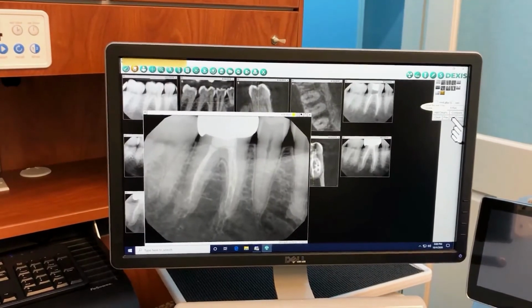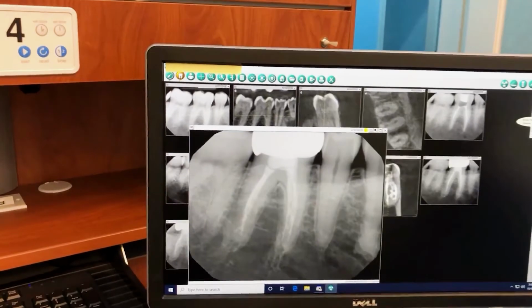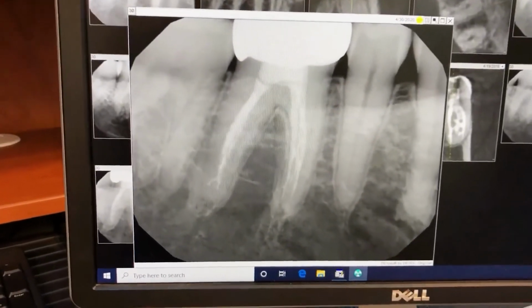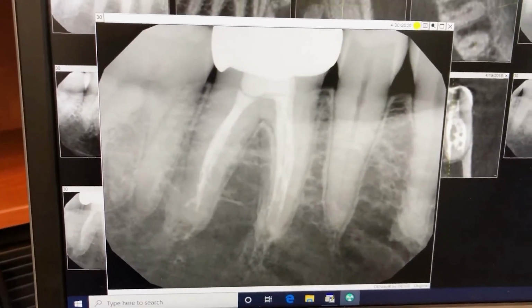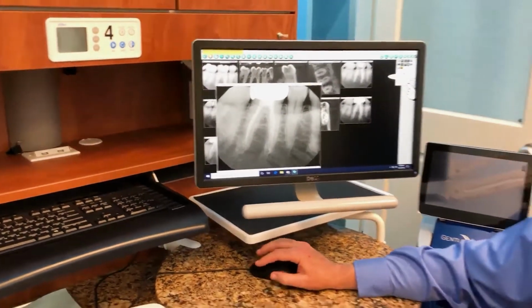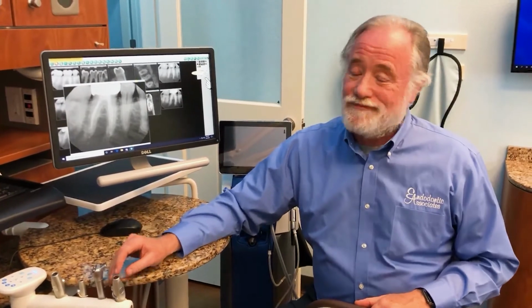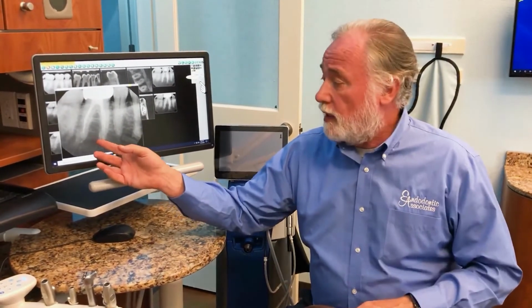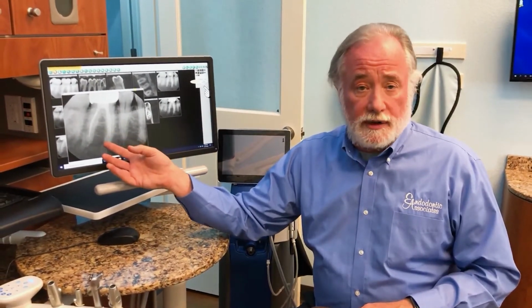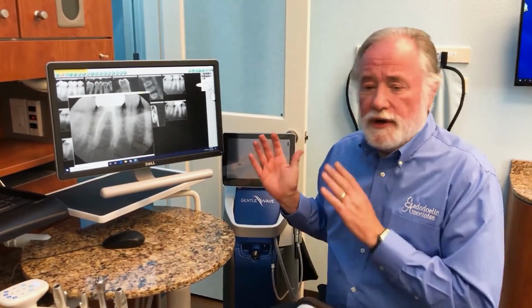And here we are then, just this year, April of 2020. So here we are at a little over a two-year follow-up on this particular case. Of course, she's doing well, and this tooth is very, very comfortable for her. Very exciting in this regard, because that would have been a lot of tissue left inside the tooth. So three to four years down the road, with a conventional root canal, we would have started seeing a dark area forming down here at the bottom, indicating a reinfection. So the Gentle Wave, a tremendous thing.